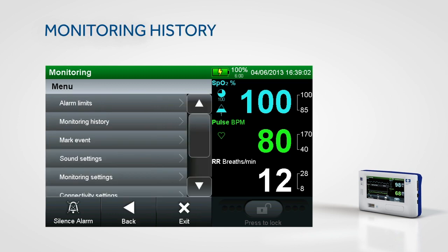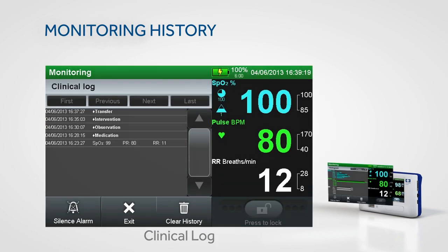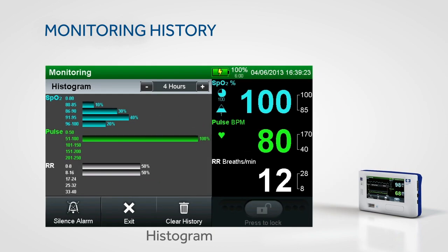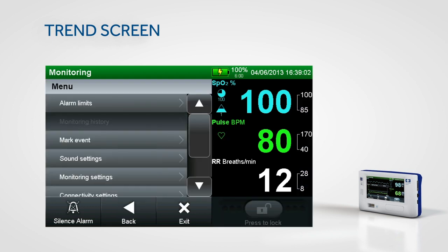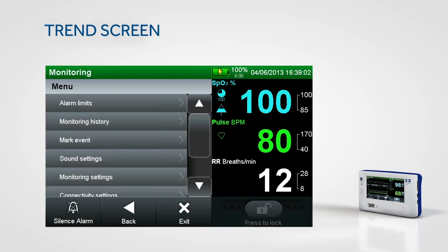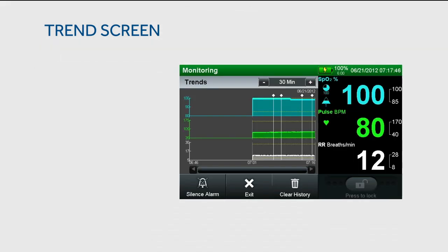Under the monitoring history submenu, you can review monitoring history by trend, clinical log, or histogram. To access the monitoring trend information, touch menu, monitoring history submenu, and select trends. From this menu, you can view real-time trend information.